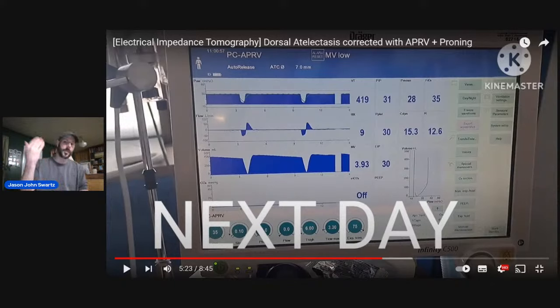But it's really going to the patient's bedside, trying the ACPC, ACVC conventional mode, doing an optimal PEEP trial that you can do with your PulmoVista. It'll show you the optimal PEEP. It'll show you where there's atelectasis, show you where there's overdistension, and give you that optimal PEEP.